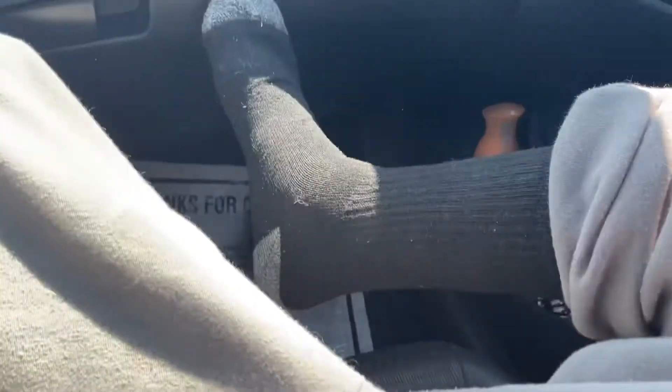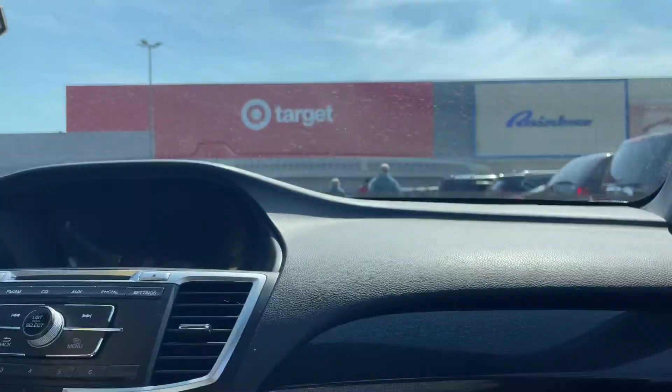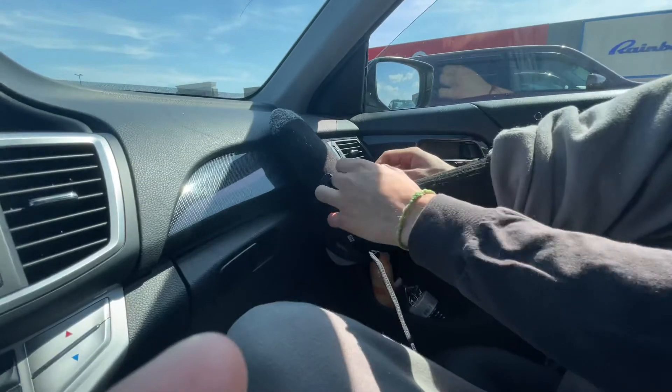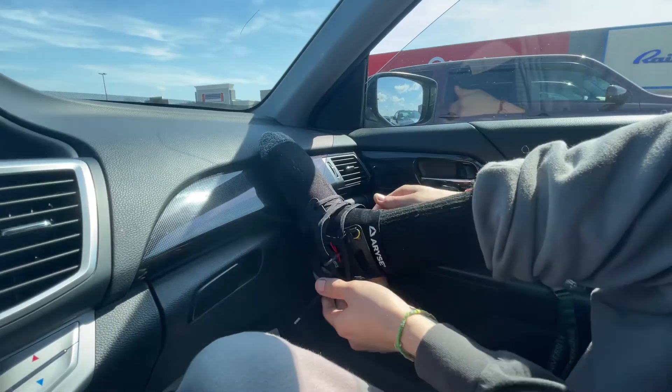My foot's really swollen and I honestly should have got a medium. I don't know if this is gonna fit. So we're lacing it up — we got it on the foot somehow. It's still a little tight.